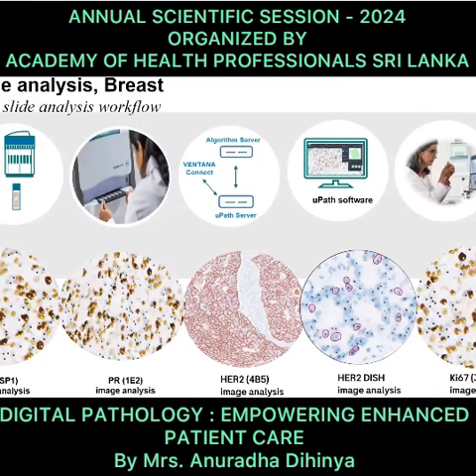But usually, what happens is the algorithm pieces come with a license. You need to take into consideration that they come with a cost. So when you're going ahead with the scanner, they require a stringent validation process. Once your validation process has been completed for your digital pathology, and your pathologists and technical staff are comfortable using the digital scanners, after that, I would suggest that you go with the AI algorithm piece for your laboratory.